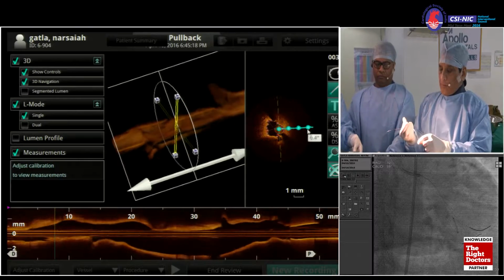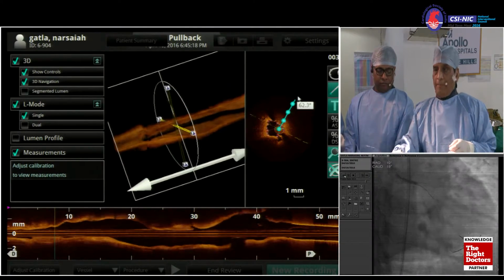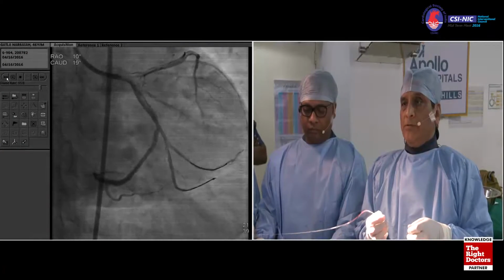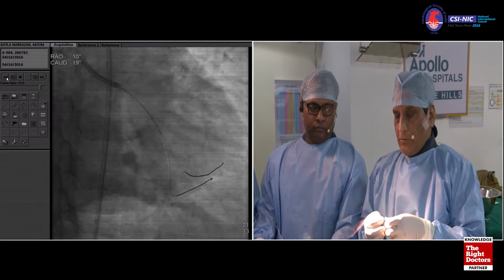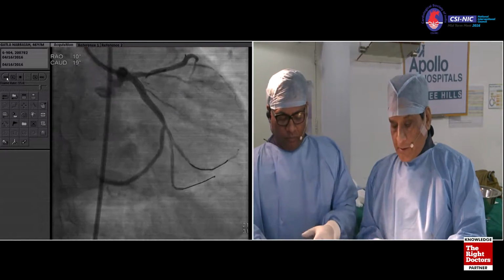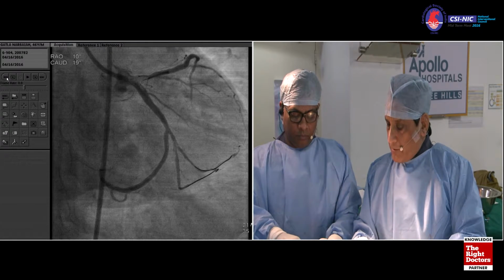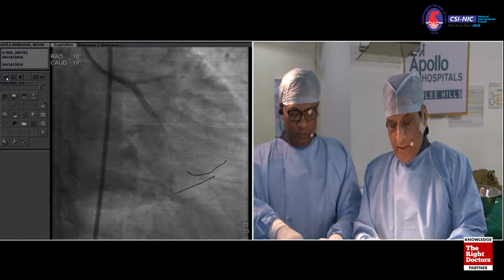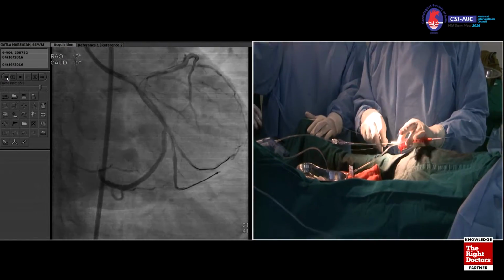Yeah, go back to the picture after dilatation. See, with such a high plaque, once you have these dissections, those are common. Once you have those dissections, you know that your FFR will be positive. I would say the side branch is probably questionable when you have a moderate disease. If you have significant disease, actually we have some other views also.